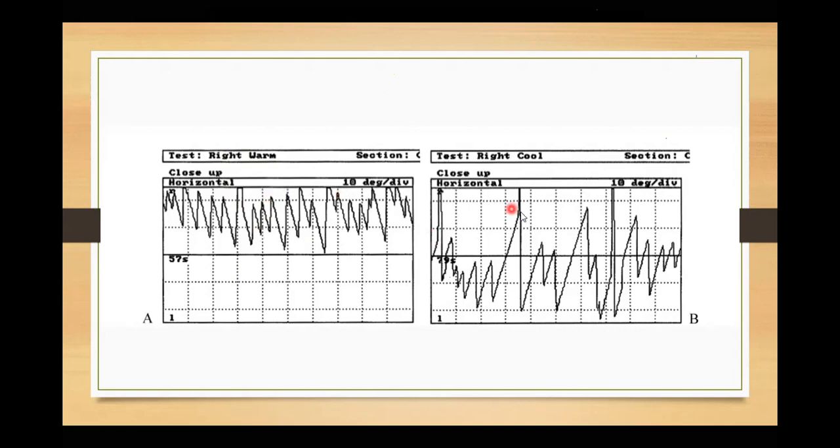Okay, fine. Here, look at the sloping one. Sloping one is towards the right side, you always have to see on the right side. From here to here, down to up, which means left to right, not right to left. So it is up, and this is sloping.